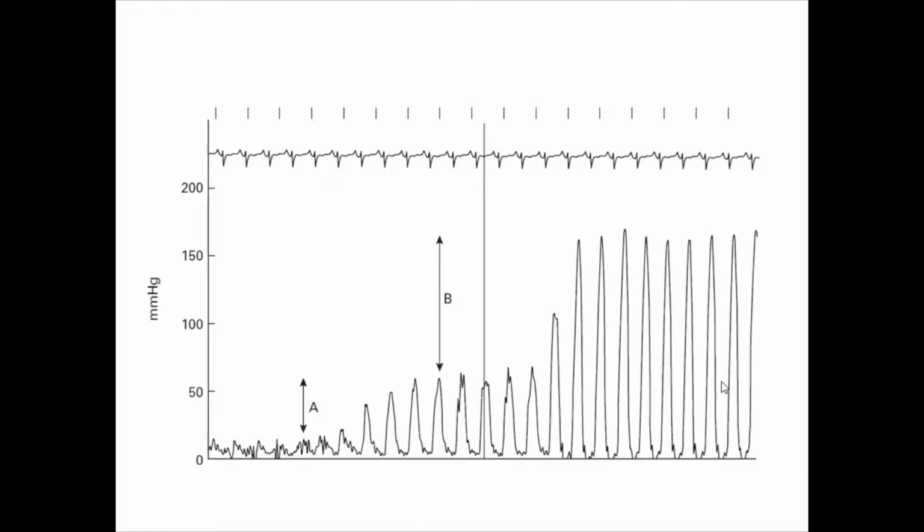This is the pulmonary artery pressure. And this is the RV pressure.